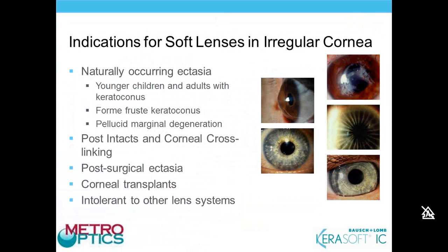Patients that underwent refractive surgery and had a poor outcome, typically the post-LASIK ectasia patients or the radial keratotomy patients, they also are candidates for the KIC lens design.